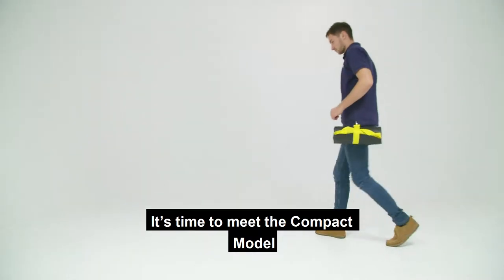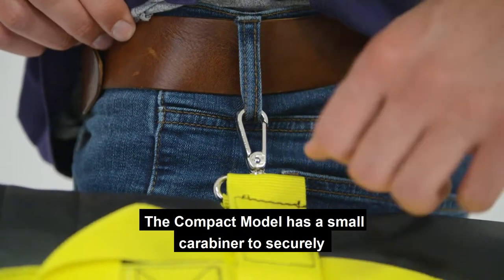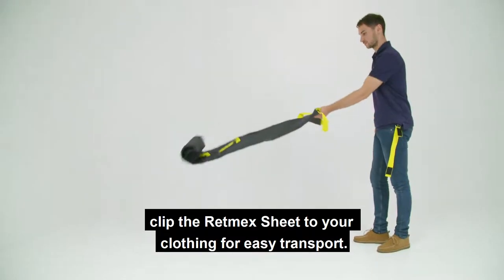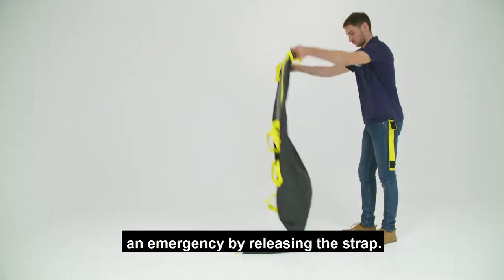It's time to meet the compact model of the RETMEX Rescue Sheet. The compact model has a small carabiner to securely clip the RETMEX sheet to your clothing for easy transport. You can quickly unroll the sheet in the event of an emergency by releasing the strap.